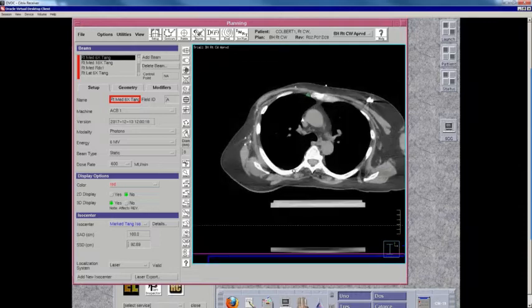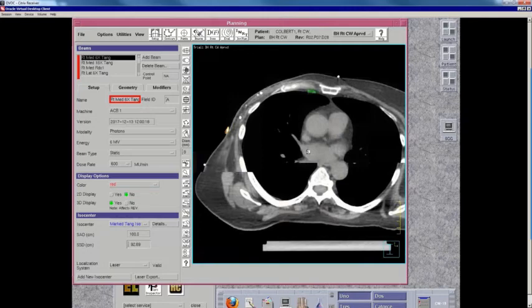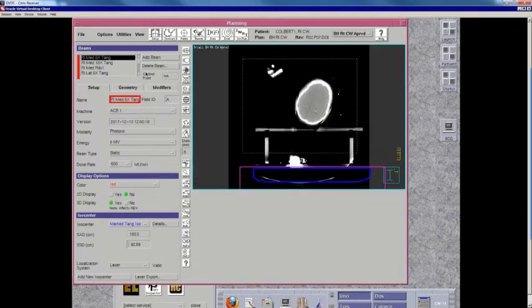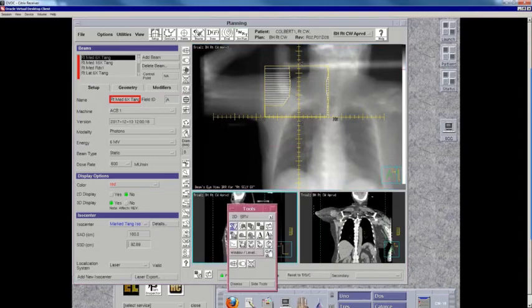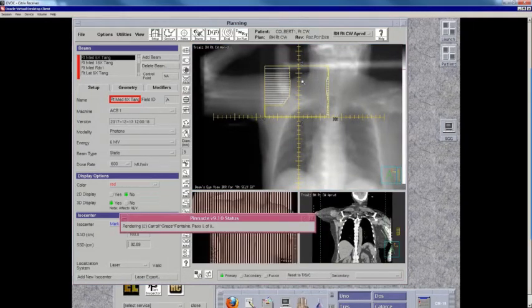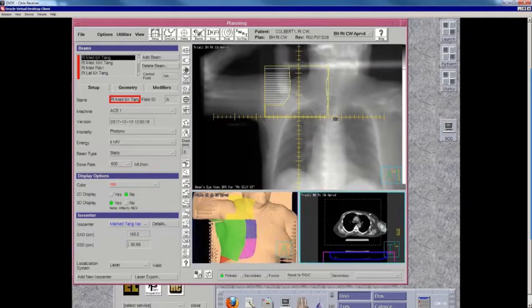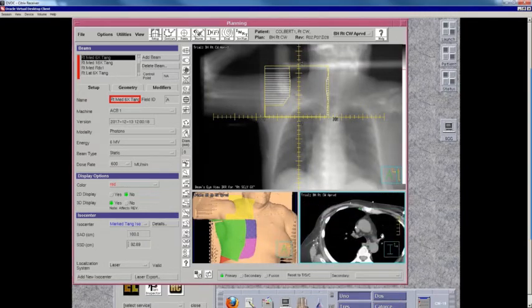So now that we've done just a little bit of very simple contouring, obviously, now we can start to put our fields on. We already talked about isocenters on the last case, so we're going to skip that, and we're going to talk about our field. Again, I always set up my windows the same way to minimize mistakes. I like to look at my DRR in this window, my skin rendering in this window, and my axial CT slice in this window. Combining all these together is very helpful because each tells you something a little bit different about the patient.